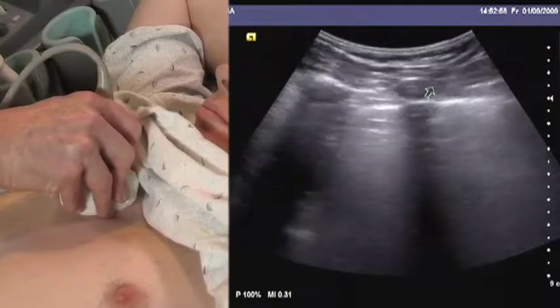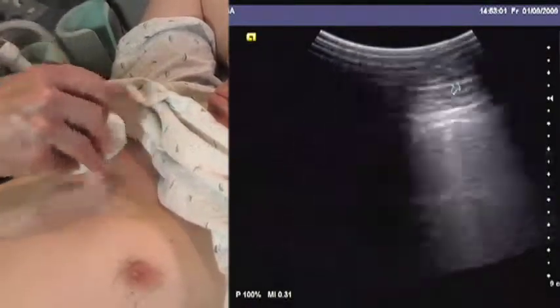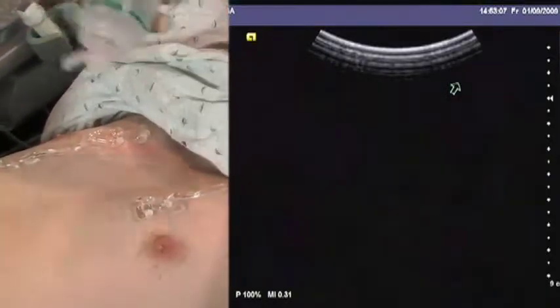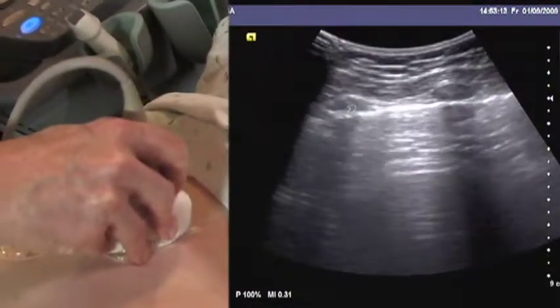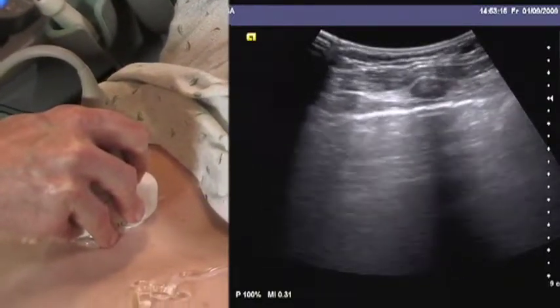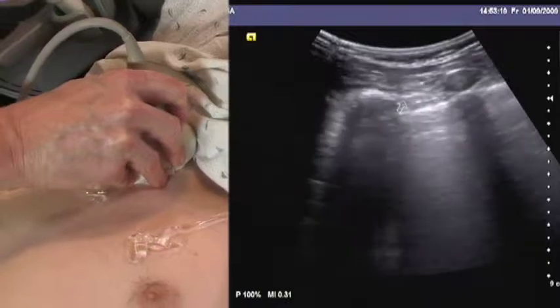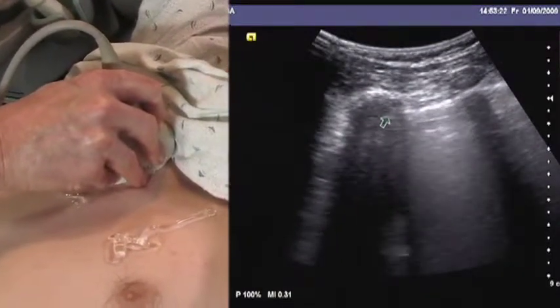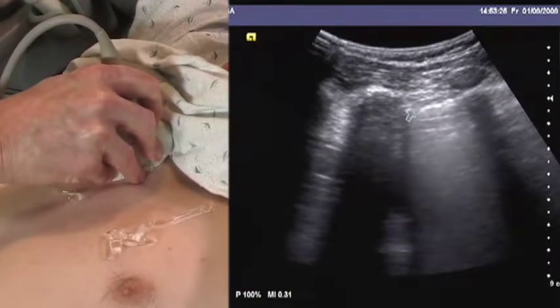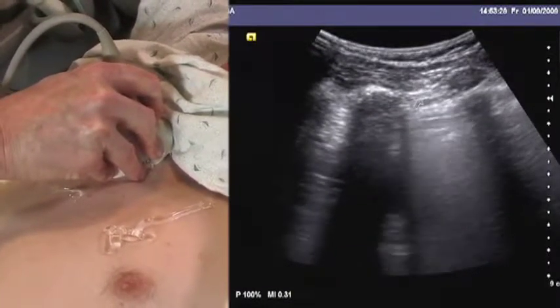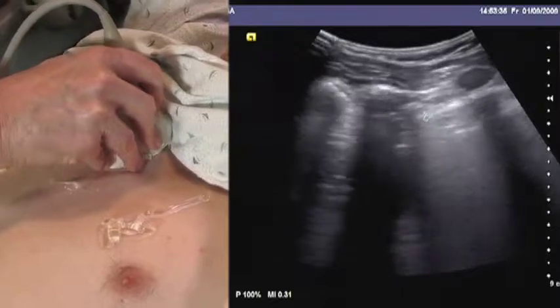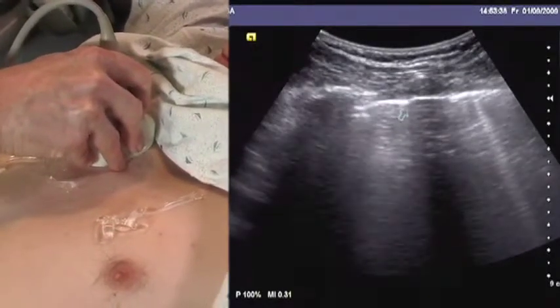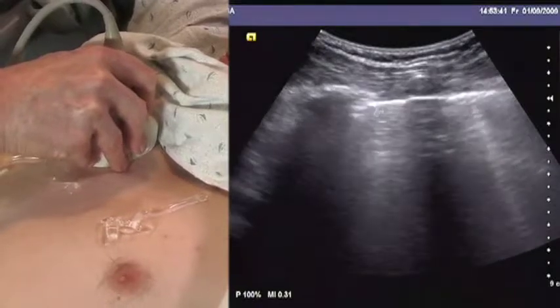With those settings adjusted, it's easy to see the ribs with their characteristic shadows. The location we're looking at is immediately under the rib — this white line. It's important to locate this pleural line and distinguish it from other white lines such as intermuscular structures and reverberation artifacts behind the pleural line. The pleural line is then evaluated for longitudinal motion.